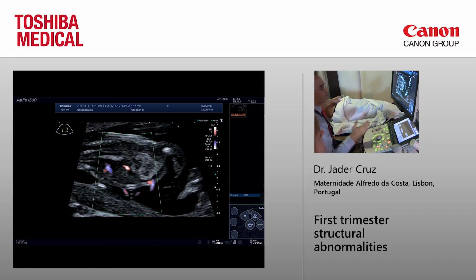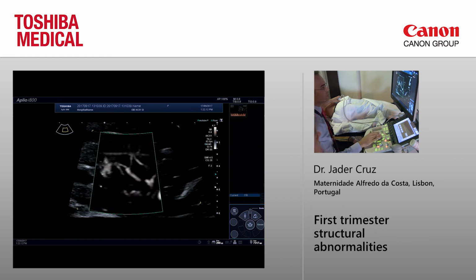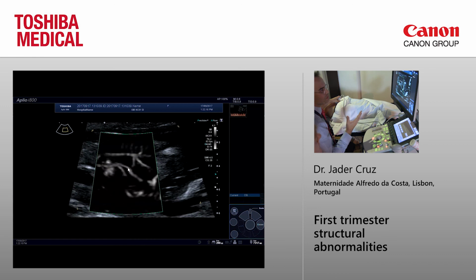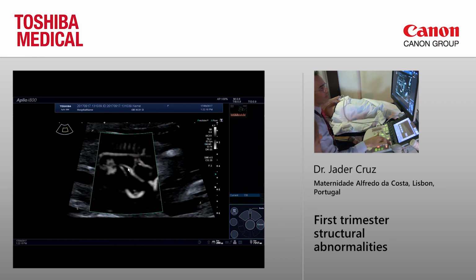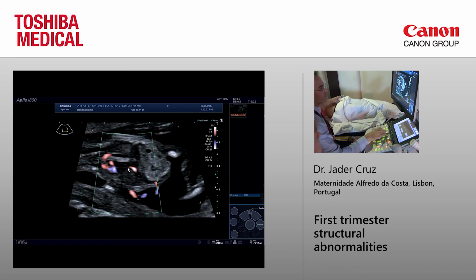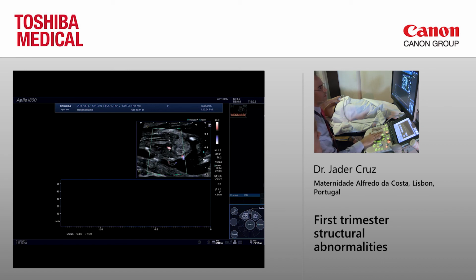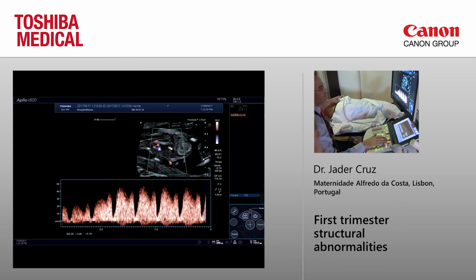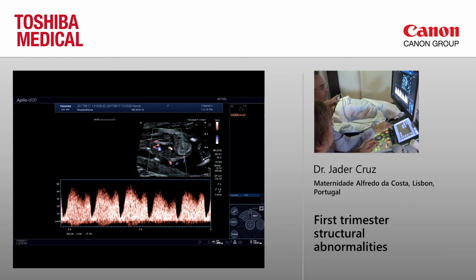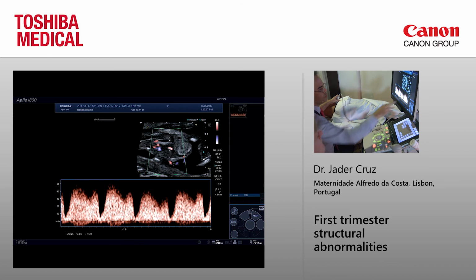But I like to measure. Of course, you can see that with the SMI. You can see where to place the caliper. You see the ductus venosus there. You don't really need to rely on the aliasing. So then you just measure that. Okay. Then you should increase the sweep speed. Yeah, you should have a higher sweep speed to see the A wave better, and then you measure.